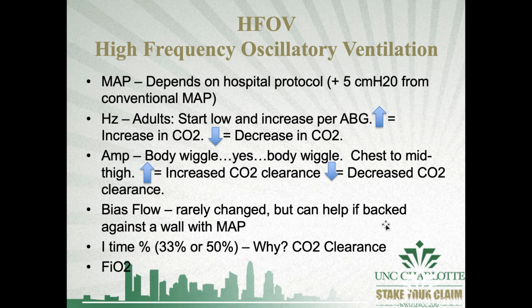Okay, that's it for the gases. Let's talk about the oscillator. I probably should have moved this up to the APRV section for a smoother transition, but we're going to knock this out as well, because using the oscillator is kind of a lost art, and I think it could be effective, but in the world of ECMO and everything else, it's becoming far less used. But I will say I have had a patient on the oscillator and ECMO. I've had a patient prone and on ECMO and on the oscillator.